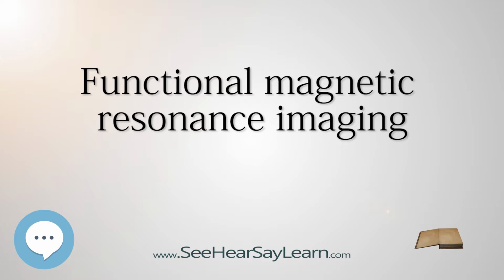Most fMRI experiments study brain processes lasting a few seconds, with the study conducted over some tens of minutes. Subjects may move their heads during that time, and this head motion needs to be corrected for. So does drift in the baseline signal over time. Boredom and learning may modify both subject behavior and cognitive processes.